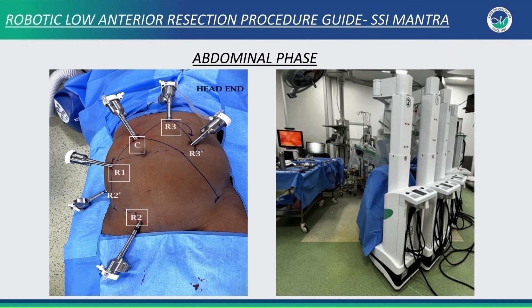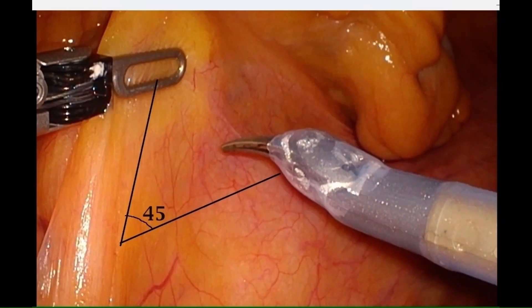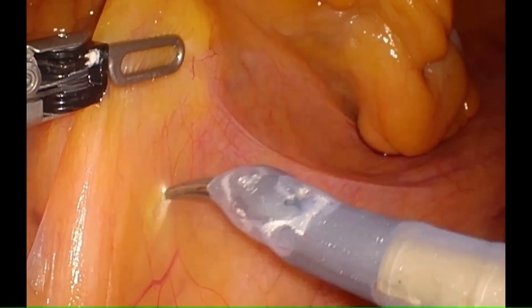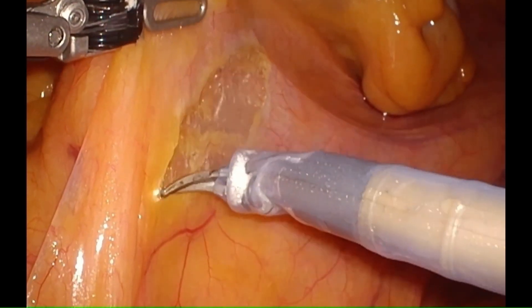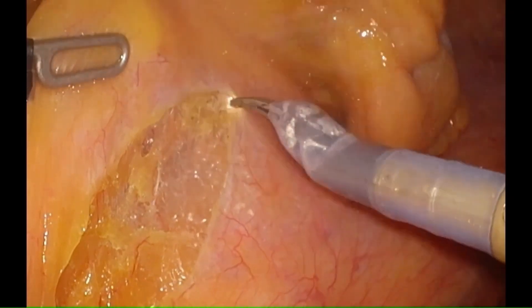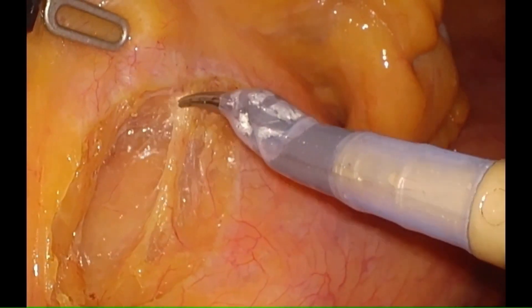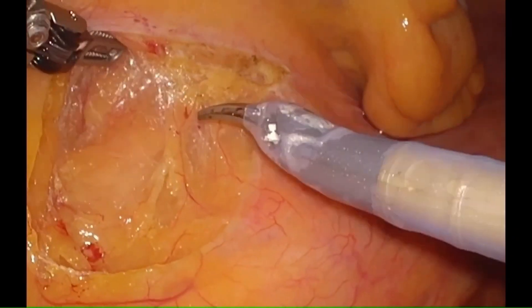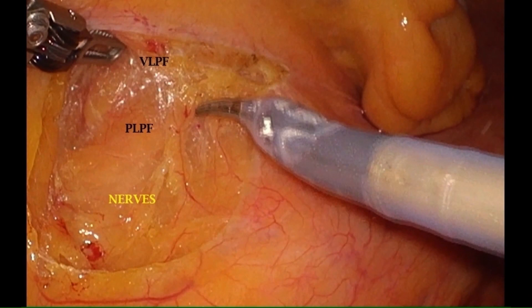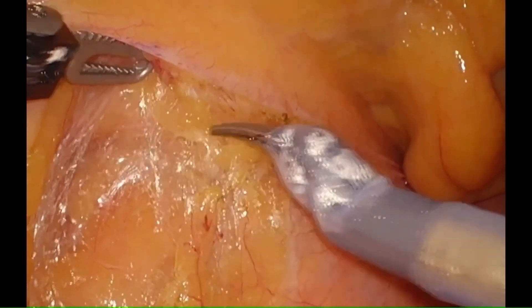We start with the abdominal phase with port placement and cart position as shown. We lift the IMA pedicle at 45 degrees from midline. A sharp cut is made in the peritoneum. As the pneumoperitoneum enters the retroperitoneum, it allows us to easily identify the plane between the visceral layer and the parietal layer of pelvic fascia.